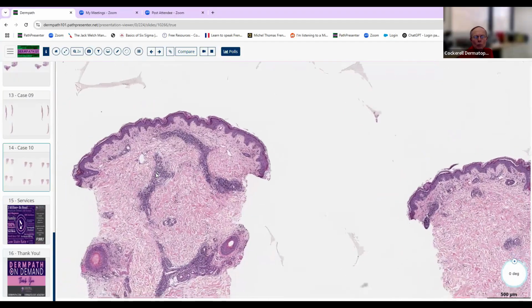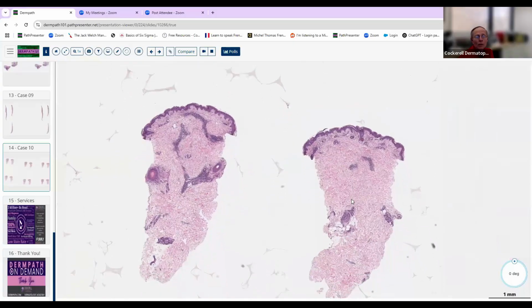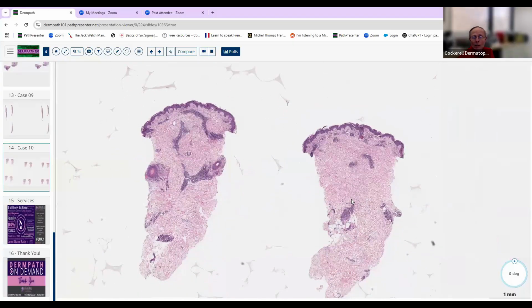One other thing I would kind of throw in the differential we see on occasion is pernio. So if you see this pattern on acral skin, think of pernio. That often gives you a little bit of interface change with some papillodermal edema as well. But this is a nice example of one of the lymphocytic infiltrates here. So that's how you do it.